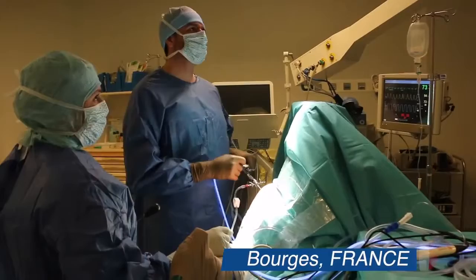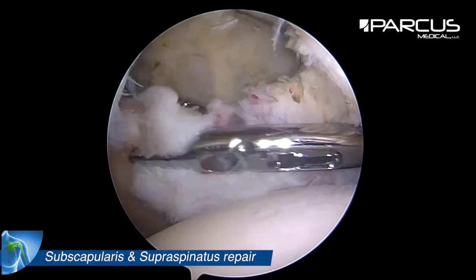This video will demonstrate a single row repair of a subscapularis tear and a double row repair of a supraspinatus tear.